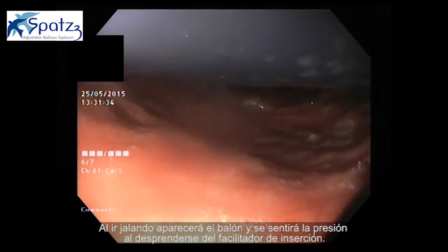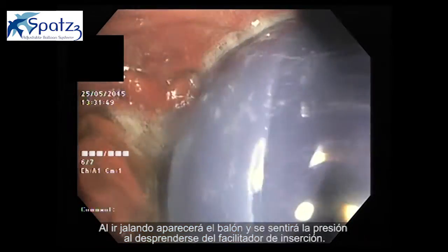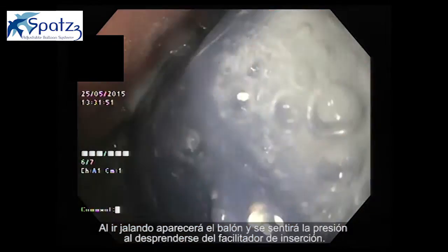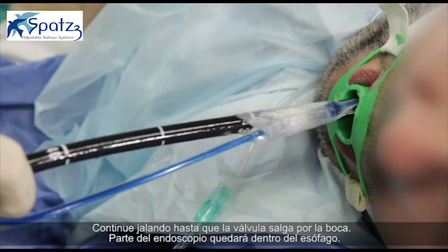As you pull back, you will see the balloon and you will feel pressure as the balloon releases from the insertion facilitator. Continue pulling until the valve exits the mouth. Part of the endoscope remains in the esophagus.